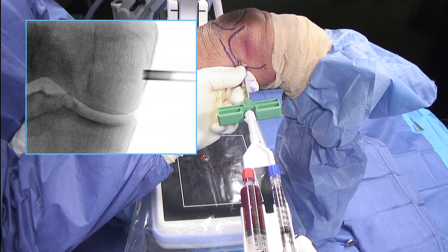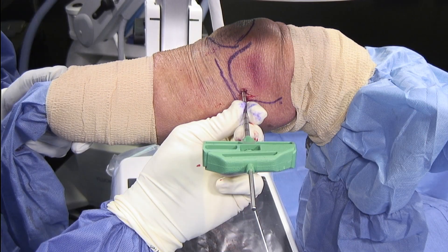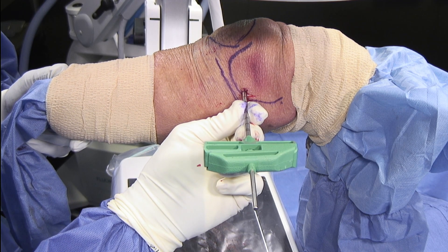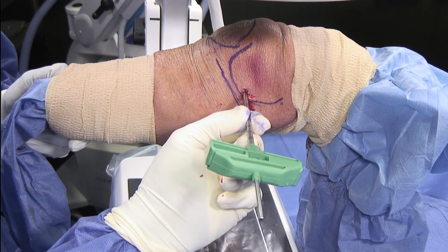After the bone marrow concentrate was injected into the lesion, the mixture of bone marrow concentrate and the calcium chloride thrombin takes approximately 30 seconds to clot. I typically leave the stylus in for one minute. After one minute, the delivery cannula and stylus is removed.